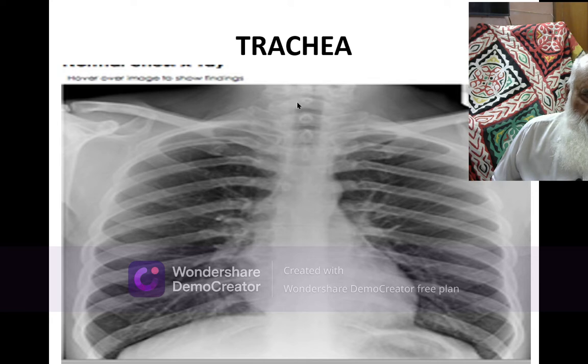There are conditions in which the pathology is present bilaterally, for example fibrosis, which will encircle all the trachea. The trachea is neither pulled nor pushed. The trachea should be displaced because the pathology is there, but it is not displaced because the forces are balanced. When the forces are balanced and pathologies are present on both sides, this is called splinting of the trachea.